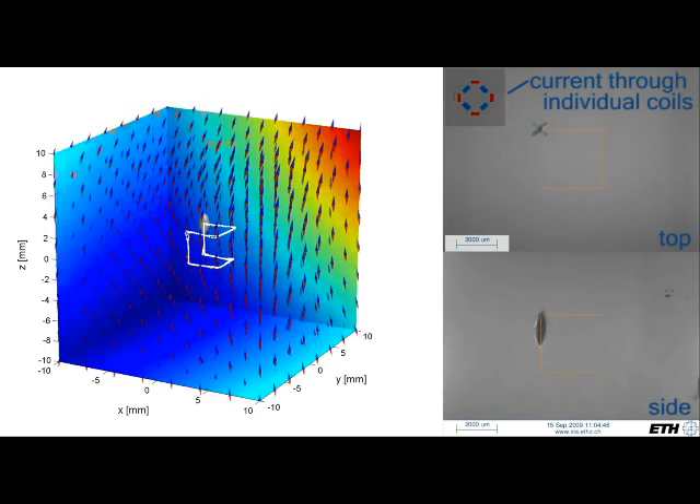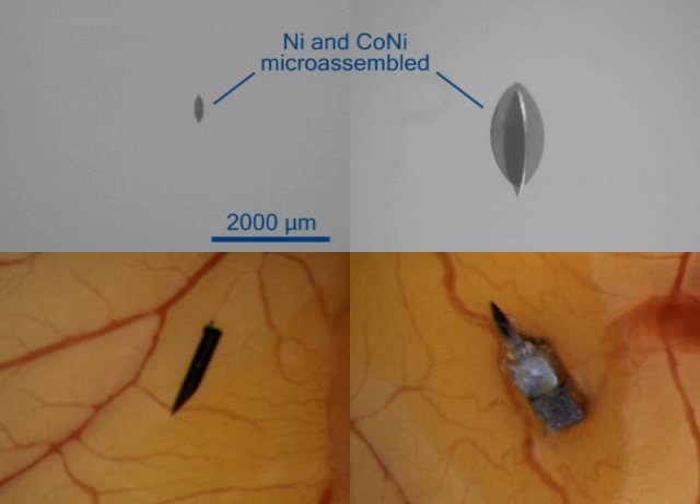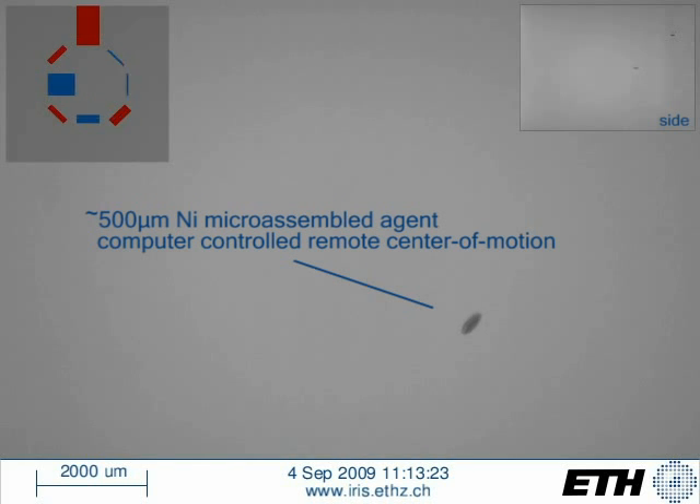A variety of devices in the millimeter and submillimeter range can be controlled. We have thus far experimented with devices made from micro-assembled cobalt nickel pieces, stainless steel tubing, and neodymium iron boron permanent magnets. Initial experiments have been performed in silicon oil with a similar viscosity to that used as a replacement to the vitreous humor after a vitrectomy.